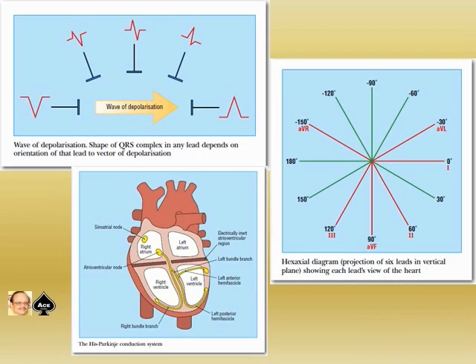So this anatomy should be understood very well to understand how the ECG changes are described in various bundle branch blocks, nodal blocks, atrial tachyarrhythmias, ventricular tachyarrhythmias, which are partly dealt with in one of the video sessions on how to interpret the adult ECG. You can visit them at www.youtube.com/ACEPGMed.